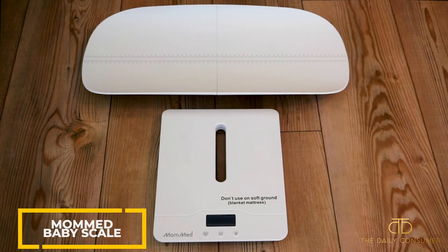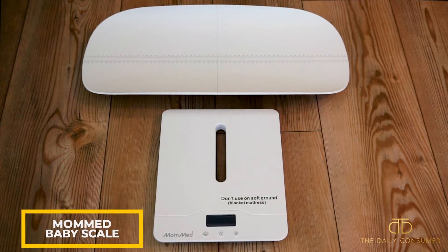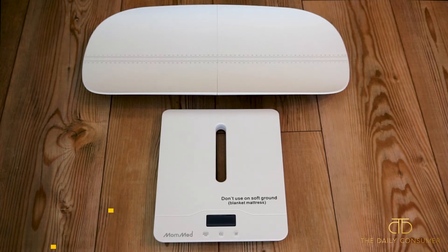Hey guys, I've got the MomMed Baby Scale here. This is a great option if you're looking for a baby scale that is going to grow with your child. You could use this with bigger babies, you could use it with toddlers, and you can use it with adults up to 220 pounds. It has that versatility so you can use it beyond just the baby phase.